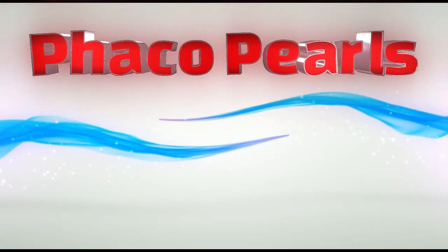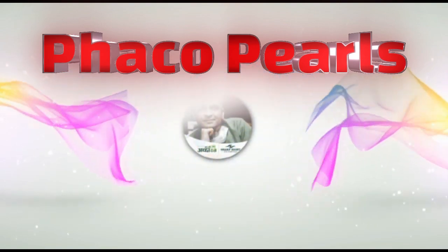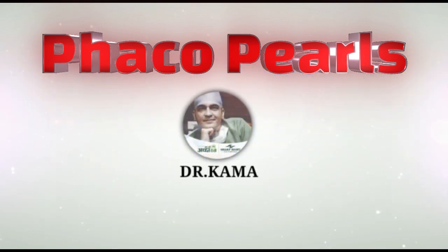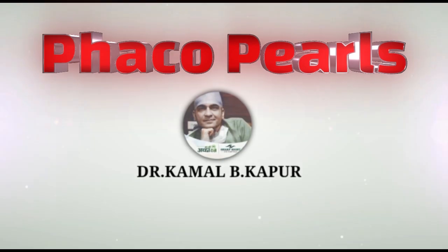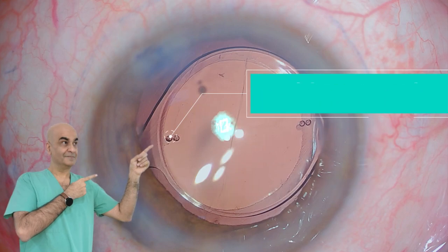This is a case where we planned to do a femtolaser with a toric IOL placement, but the required toricity of the IOL was not available. We were getting a lower powered toricity than required, so we decided to use the IntelliAxis and also arcuate clear corneal incisions to compensate for the lower astigmatic IOL available.